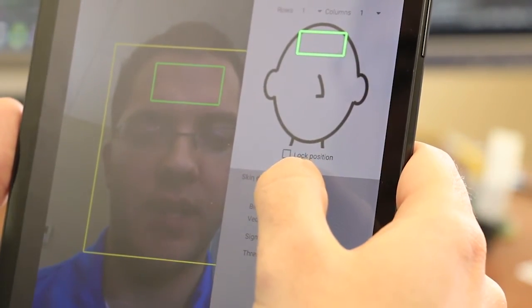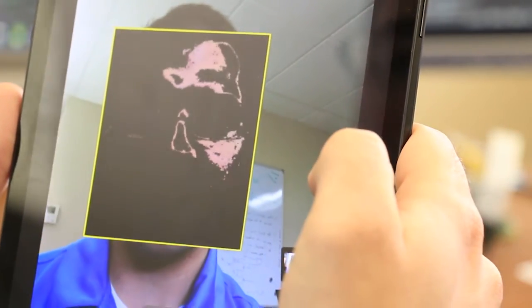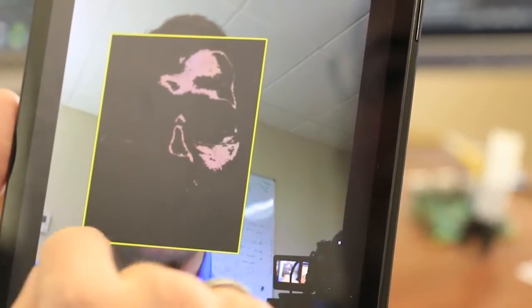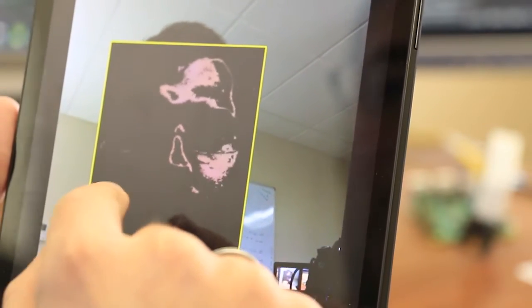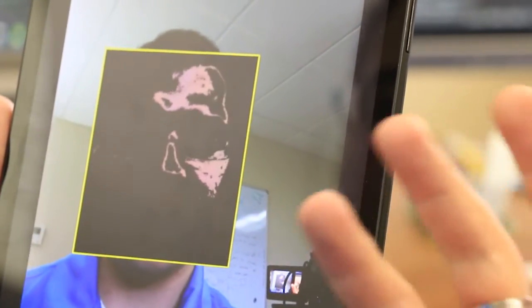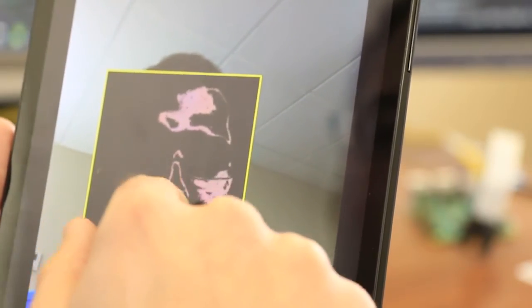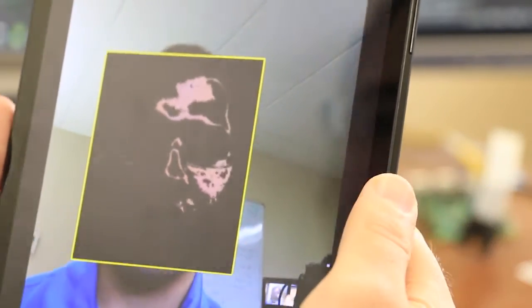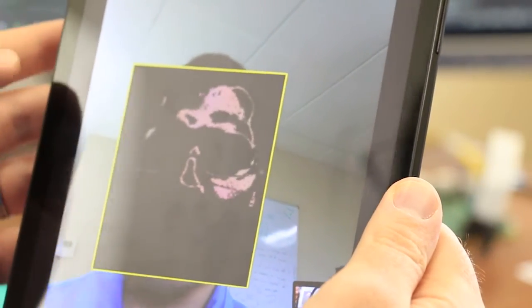Let's take a look at a skin detector that we've developed, and what this does is it classifies all of the pixels within the face box as either being skin or non-skin. As you can tell, it doesn't get all of my skin, but it does get the most important parts. It does have part of my forehead, a little bit of my nose, my cheek, and those are good areas to look for heart rate. So I'm pretty happy with that.